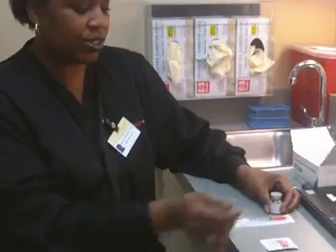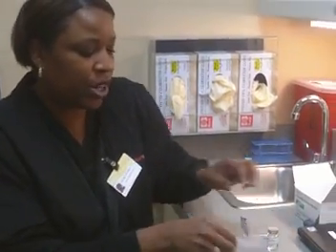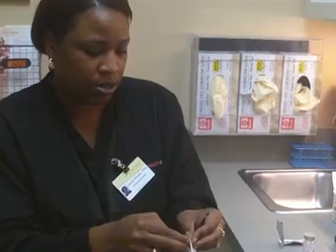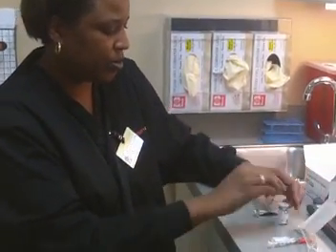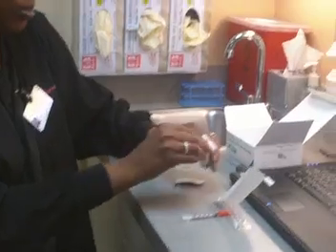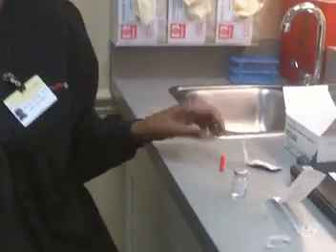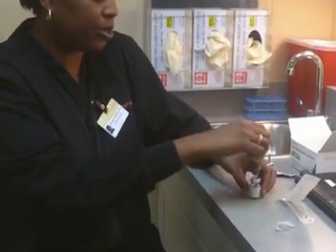What you're going to do with your Lupron is you're going to flip the cap off, take your alcohol, and clean off the top of your vial. You are going to open up your syringe, take your cap off — and this is what your needle looks like. You are going to stick your needle in the top of your Lupron.